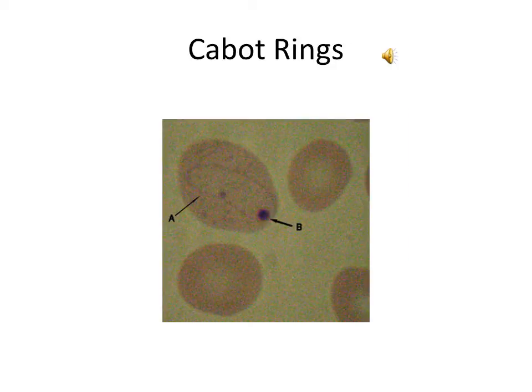While this Cabot ring looks more circular than figure 8, this is a Cabot ring. You should also notice heavy basophilic stippling, and what's noted as B on this slide is the Howell-Jolly body. Cabot rings are found in megaloblastic anemias, thalassemia syndromes that are homozygous, and post-splenectomy.